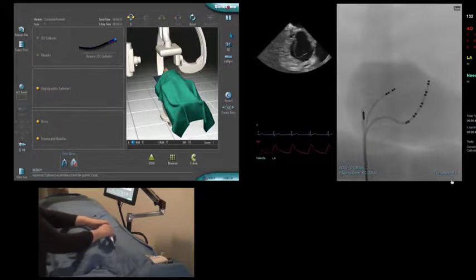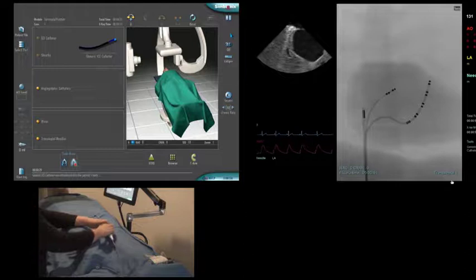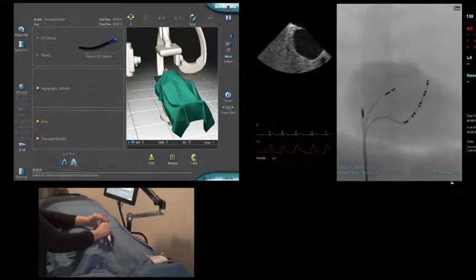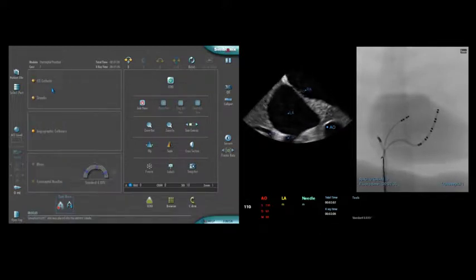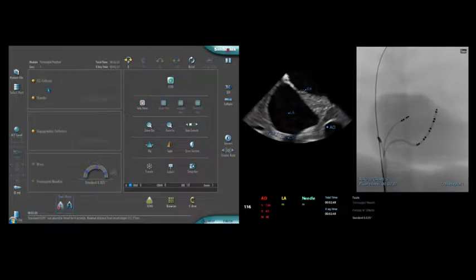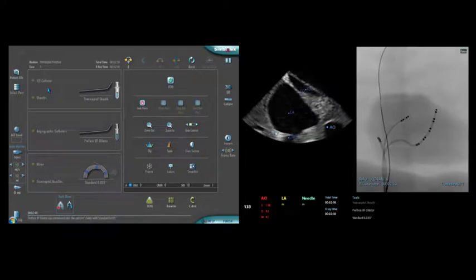Again, these are high fidelity hybrid simulations, which means that you have a haptic device, which is basically the virtual patient, and then you have the screen of a dedicated computer, which tells you what happens in the haptic device, provided that the proximal part of every tool is real, while the distal part of the tool is simulated. You see here we have reached the nice view in the center of the screen, the nice view of the septum.